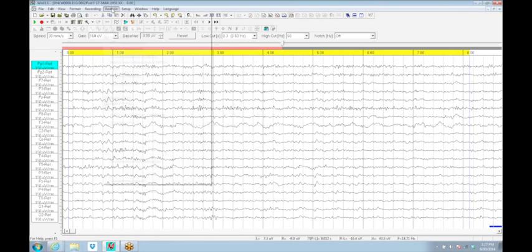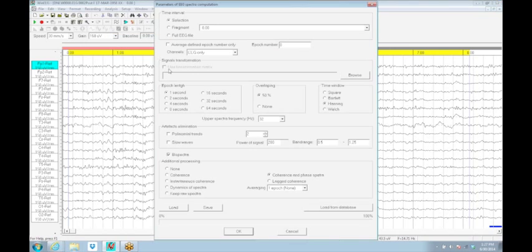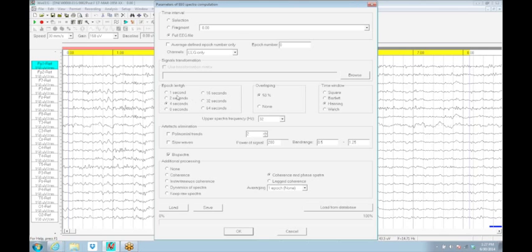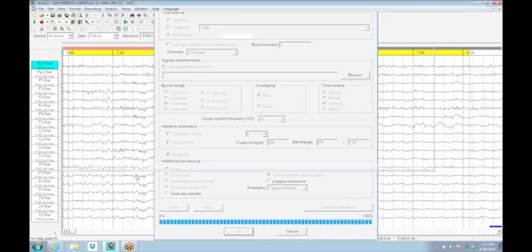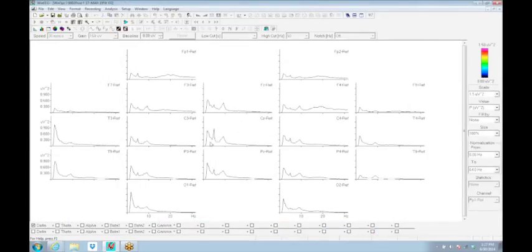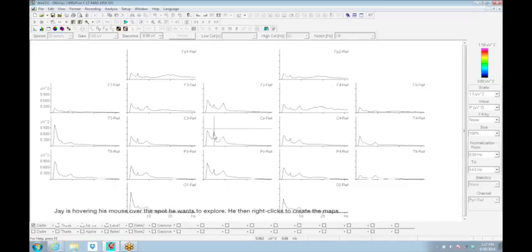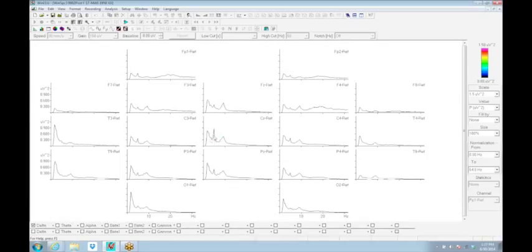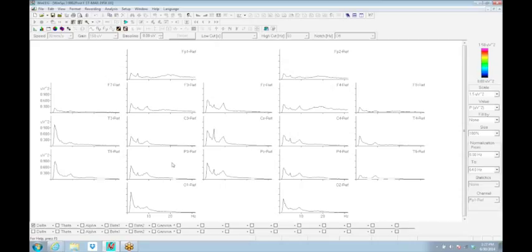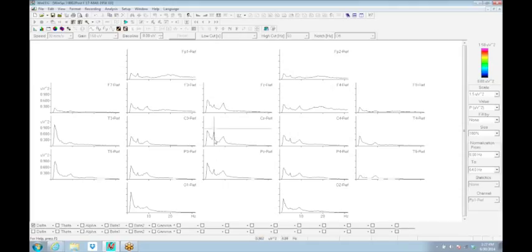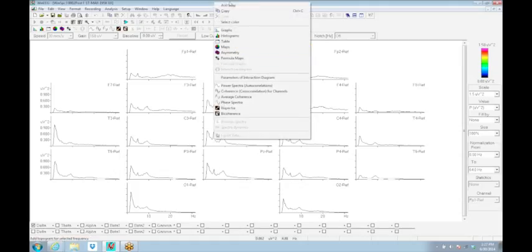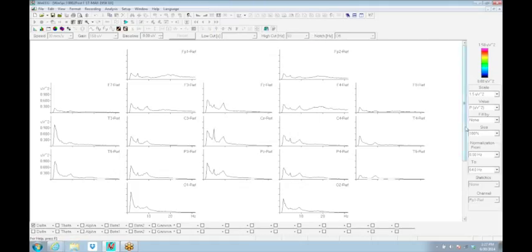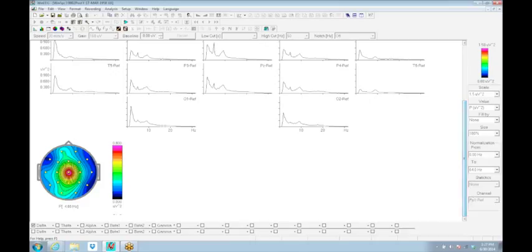It's my preference if I have the ability to use a database that has a larger epoch size. In the database here, you'll see we have a very narrow frequency peak here at 4.8 hertz. It ranges from about 4 to about 6. But it's a very narrow little peak. That was missing with the one hertz resolution. It was blended over because you can't get that resolution with that small timepiece as your epoch. The added frequency resolution gives us additional insight. If you can't see that this case has a CZ issue here, you're missing the point. That point is missing if you go to a low resolution.